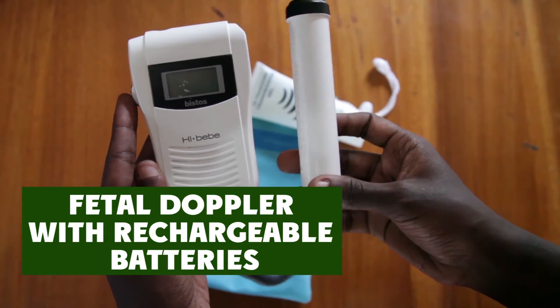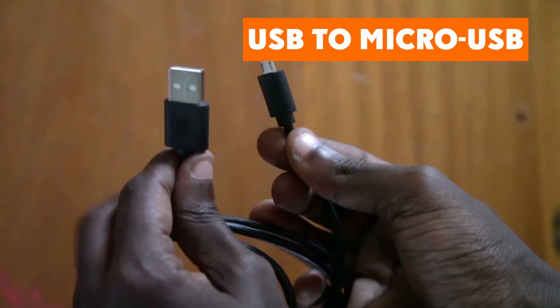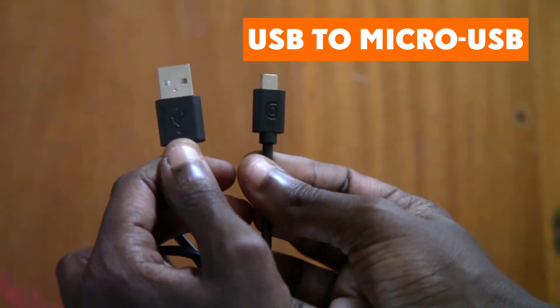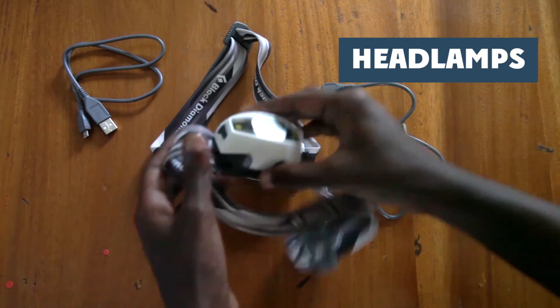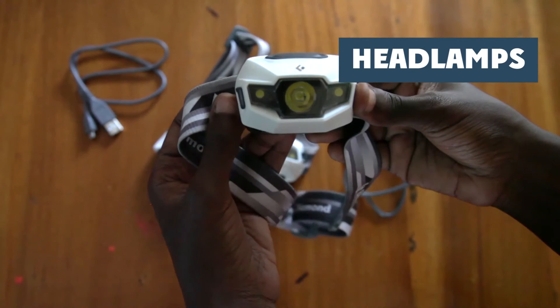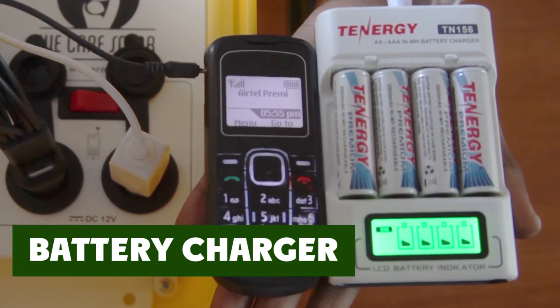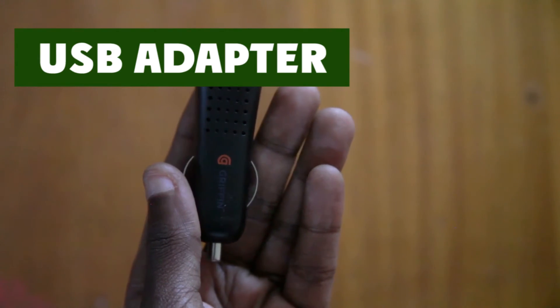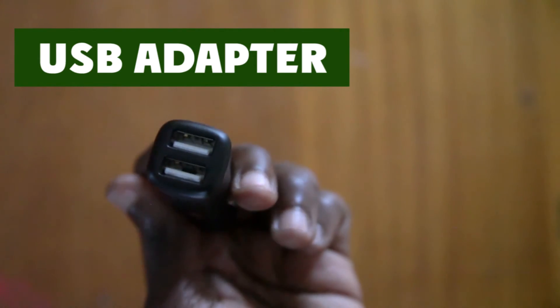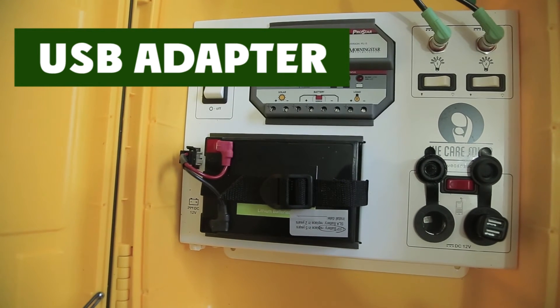Now let's look at the different appliances that come with the solar suitcase: a feto-Doppler with rechargeable batteries, a USB adapter, a USB to micro-USB wire, a multi-tip USB phone charger, two headlamps or torches with rechargeable batteries, and a battery charger. Remember, only charge appliances during the day when the green light is blinking. The USB adapter helps you charge phones and headlamps.